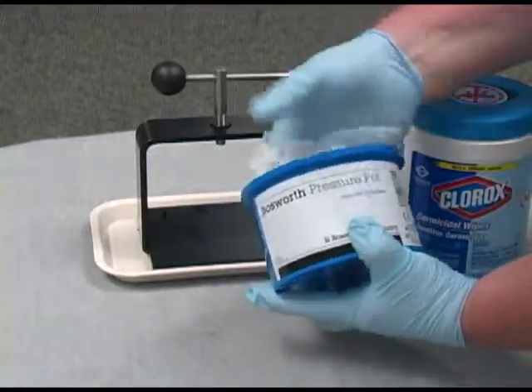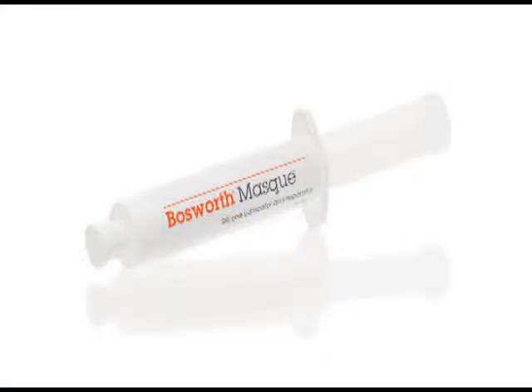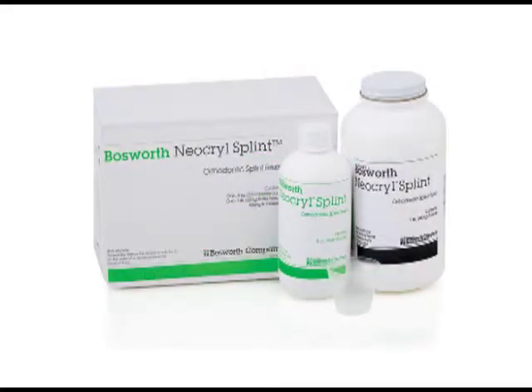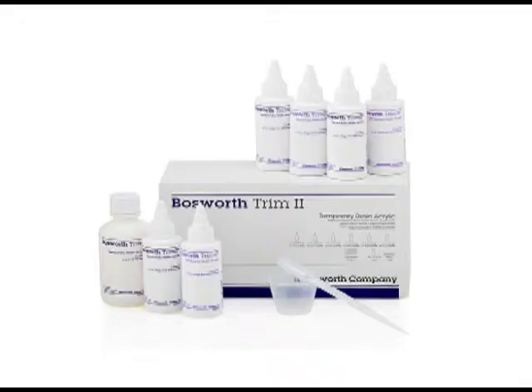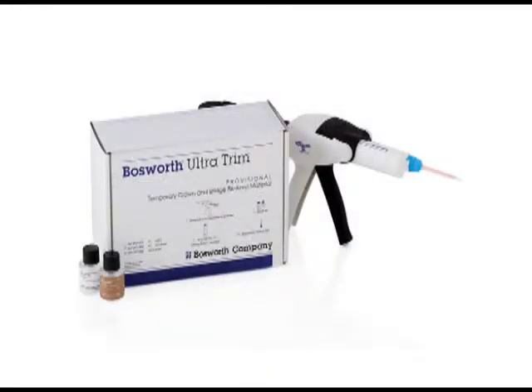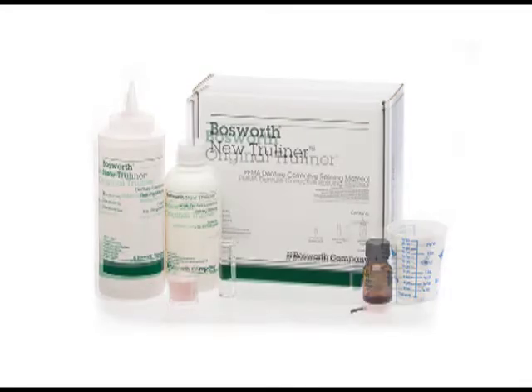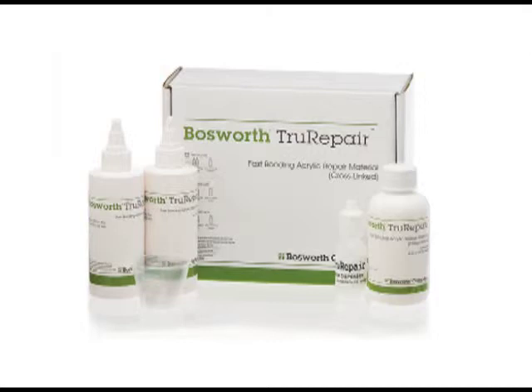Now your Bosworth Pressure Pot is ready for its next use. The Bosworth Pressure Pot may be used with the following products: Ultra Trim, which is a bisacryl material for temporary crown and bridge; New True Liner, an ethyl methacrylate dental reline material; Original True Liner, a methyl methacrylate denture reline material; and True Repair, which is a fast-bonding acrylic.